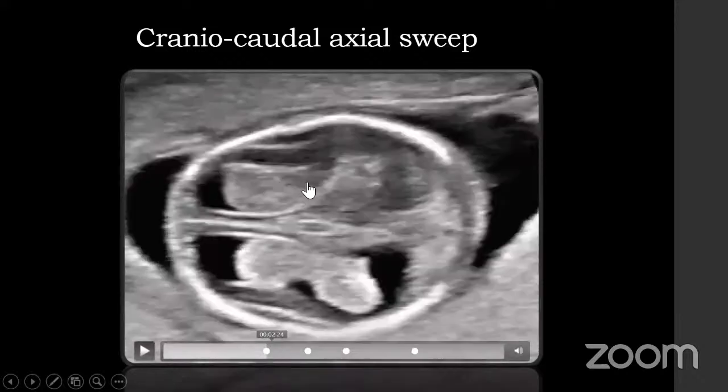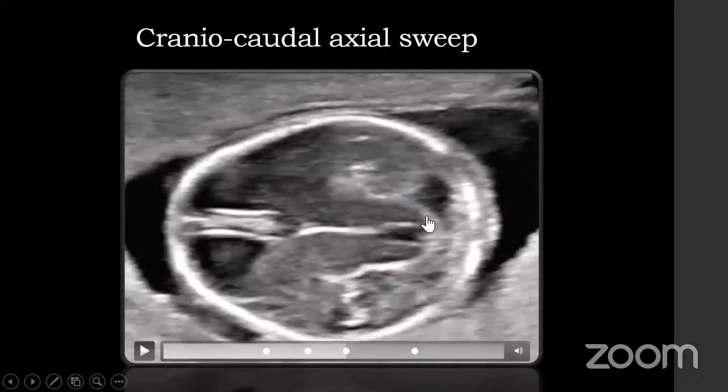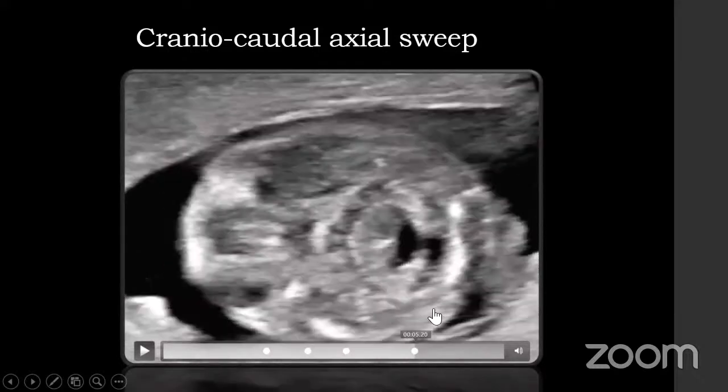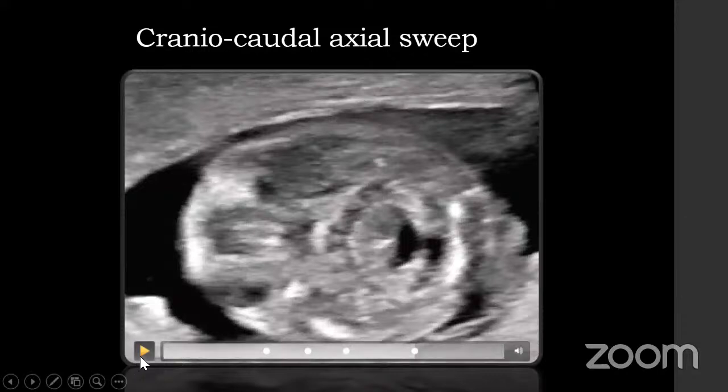At this stage, you are seeing the ventricles, vela interpositi. You go down below, you are seeing the thalami and starting to see the peduncles. You are seeing the third ventricle. Go down, you are clearly appreciating the peduncles, the aqueduct of Sylvius, the distance between the aqueduct of Sylvius and the occipital bone. You go down further, you are appreciating the hourglass configuration, which is the normal appearance of the posterior cranial fossa on an axial section. So this all takes one sweep to confirm all the three views.